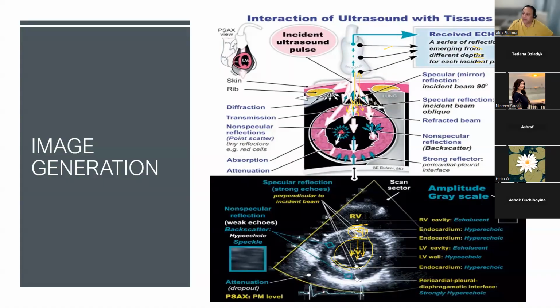Again, you then have the endocardium, which basically is tissue-like, and sound waves suddenly move from a low density to a high density tissue-like structure. There'll be more reflection from this. So at the end of the day, when you actually look at the way sound waves interact with the heart, that's what gives you the epicardial and endocardial brightness of the papillary muscles. But because there's blood which is fluid in the middle, you kind of get a very anechoic kind of an image. Does that make sense? Any questions about that? Any questions? Feel free to unmute yourself and ask me any questions if you want to.